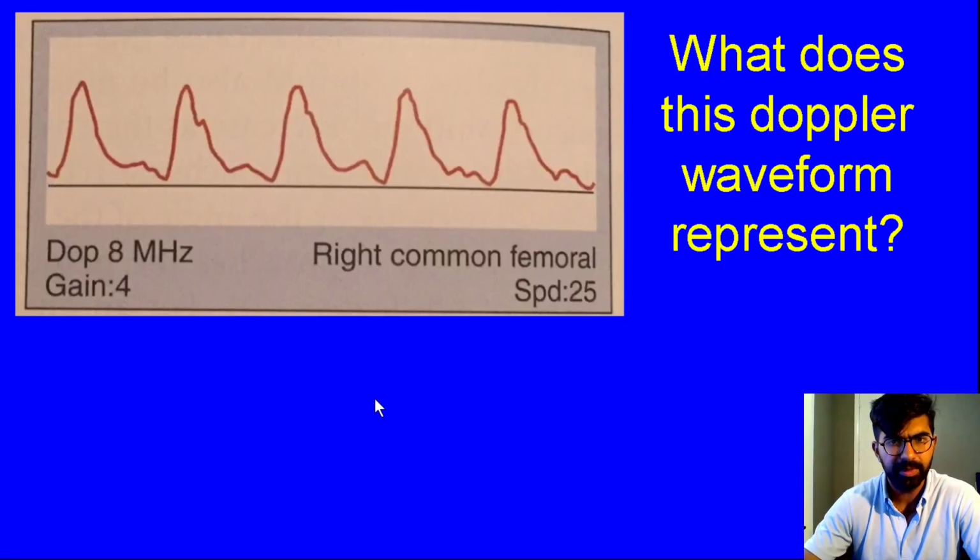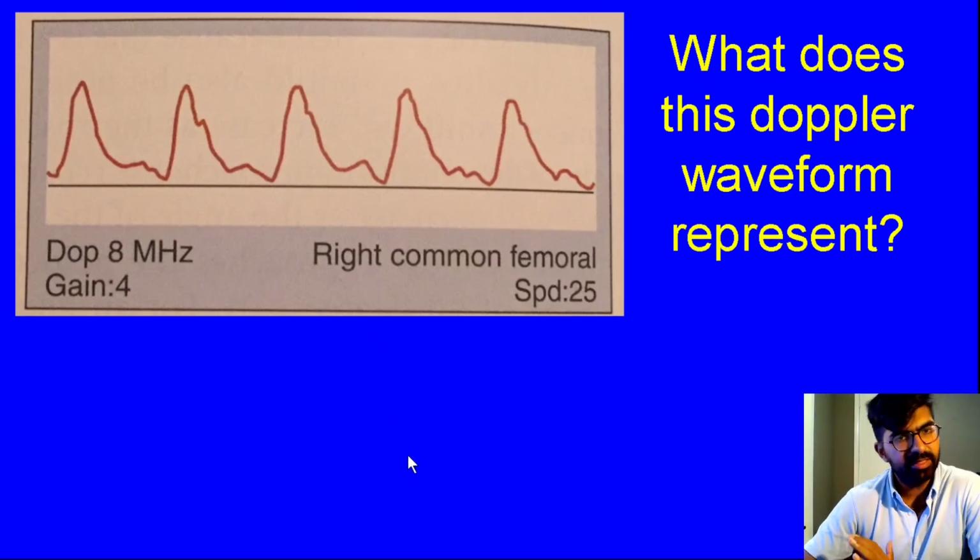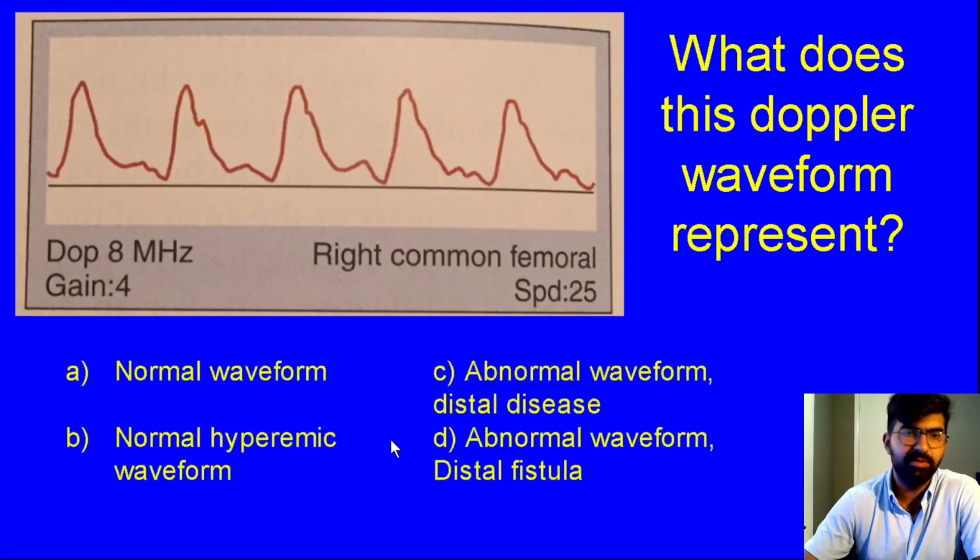So let's move on. What does this Doppler waveform represent? Now look at it carefully. It's in the right common femoral artery. And let's break it down like we did before, okay? But first, what does it represent to you?